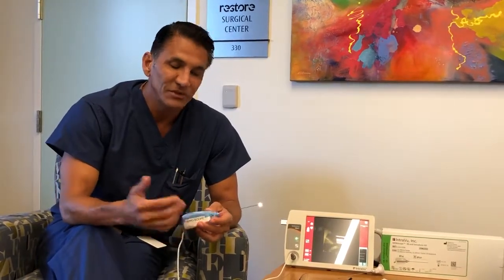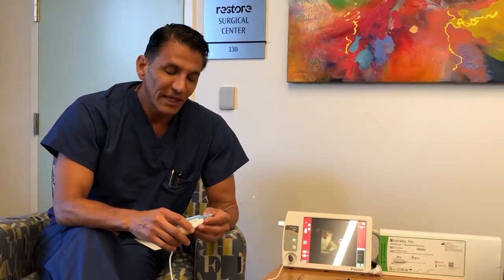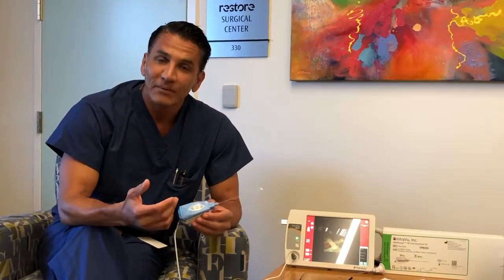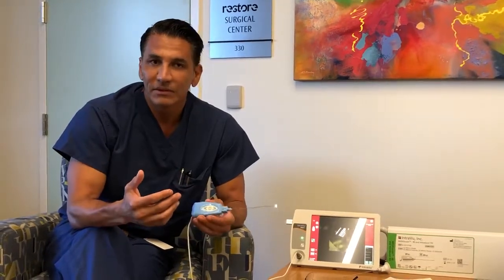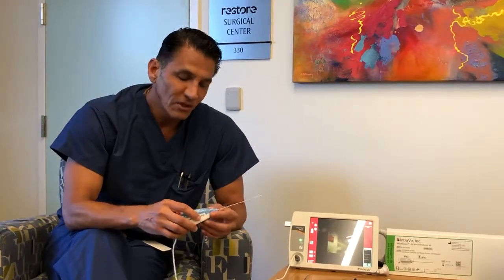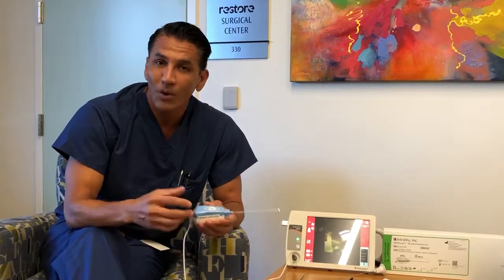I think the best use in sports medicine, or what I think is the best use, is there's actually a few. The first one that I find useful is for patients that have had a meniscus repair or who've had microfracture treatment. Maybe they're at the point where they should be getting better. They may be ready to be cleared for sports, but maybe you feel that they're not quite there yet, or perhaps you're questioning whether the lesions have healed, or perhaps the patient is having some symptoms that are suggestive of some problems or not healing.